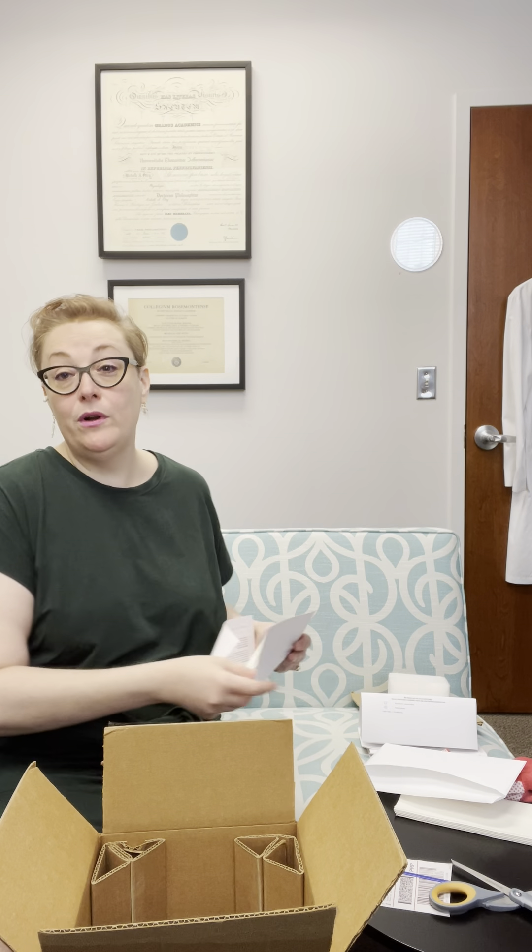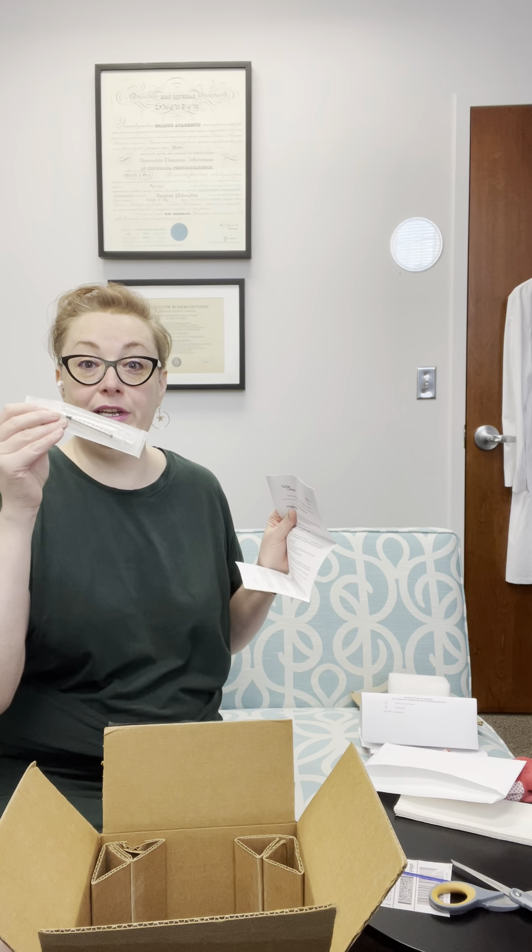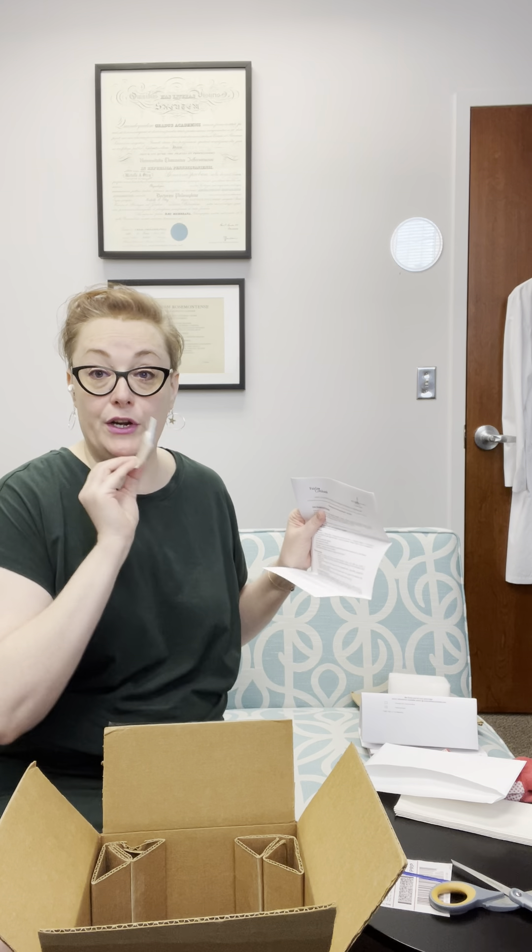It seems like a lot of paperwork because it is, but it's important and good because it covers all of the information you need to ensure you're getting what you ordered, that it's safe and ready to go. The last and most important part is your needleless syringe that you're going to use for your insemination — set that to the side — and you have instructions for home insemination that will go through everything you need.